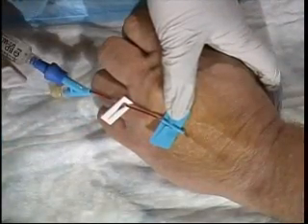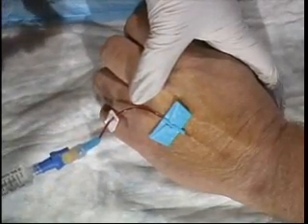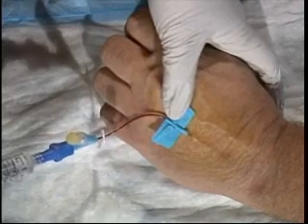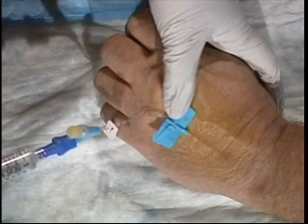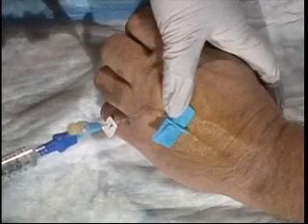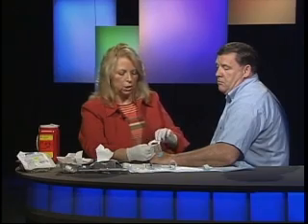The patient, I now tell, we're ready, it's in the vein, and I'm also going to reconfirm that by gently aspirating on my catheter to again make sure I have a blood return that does confirm that I'm within the lumen of the vein. I will flush forward gently and administer some of the saline flush because I don't want the blood products to occlude the catheter, thereby causing me to redo the whole procedure all over again. I remove my flush syringe, still maintaining contact with my patient because I want my patient to know that I'm still available here and that we really haven't quite finished the procedure.